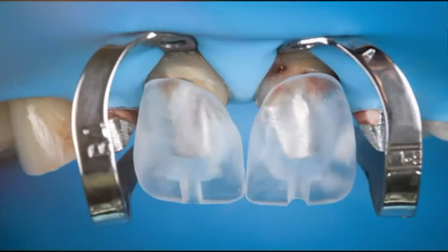And then this is very nice. I ask our technicians, and this is what we do a lot now. So imagine just as they would make the provisionals today, they can make the provisionals in a transparent PMMA, right? You just put a transparent PMMA instead of the normal PMMA and you have your final design.